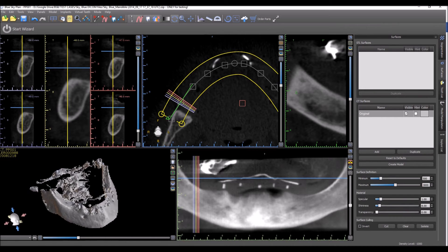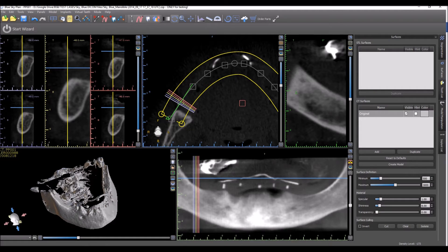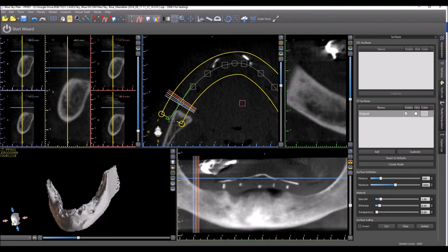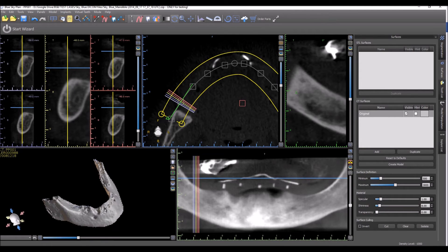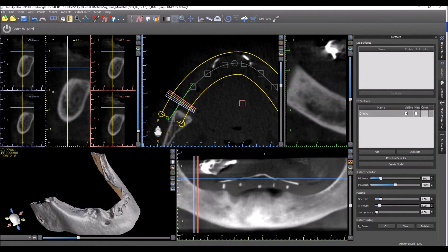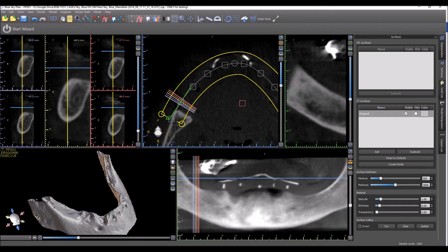As you can see we've imported an edentulous case. By going to isolate and left-clicking on the item that we want to keep, we eliminate everything else. Now if the bone is solid and dense then we can simply click on the CT surface and click create model.